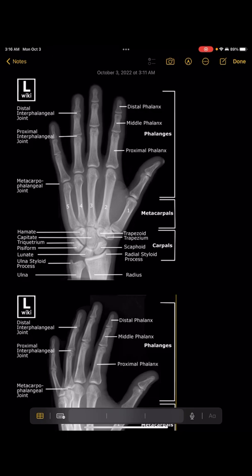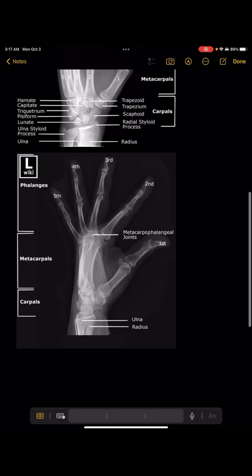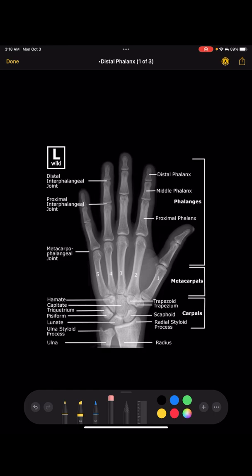Everything needs to be positioned correctly and nothing should be clipped. You want it centered correctly so that the hand is in the center, with around an inch from the edges. You want about an inch of your radius and ulna so that you can see the joint space.